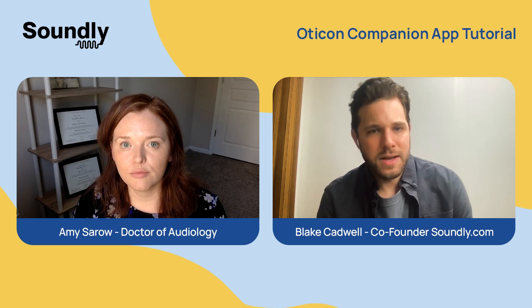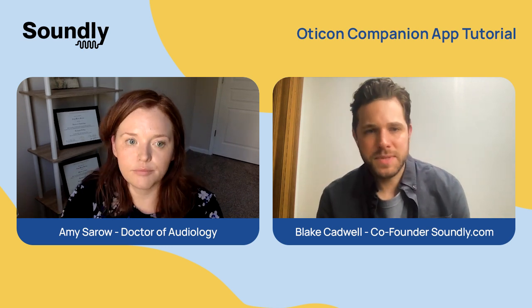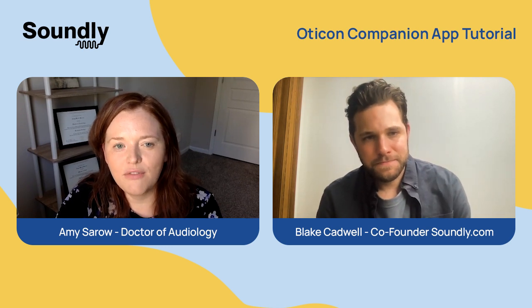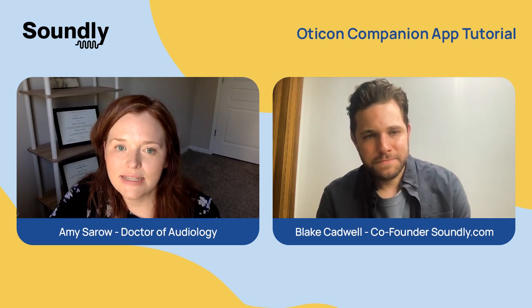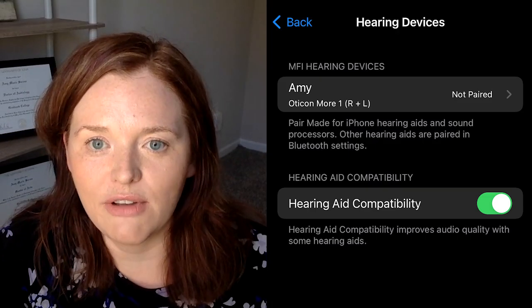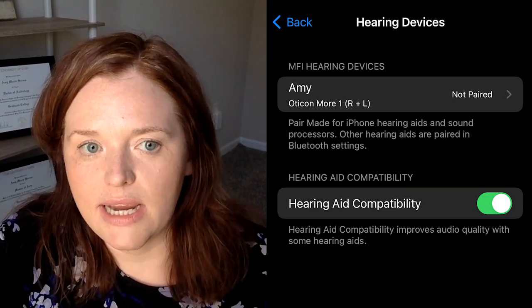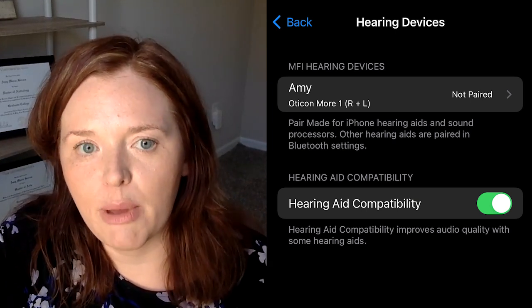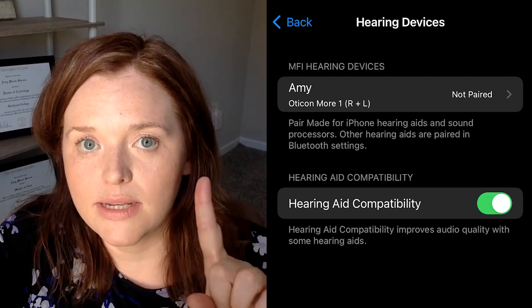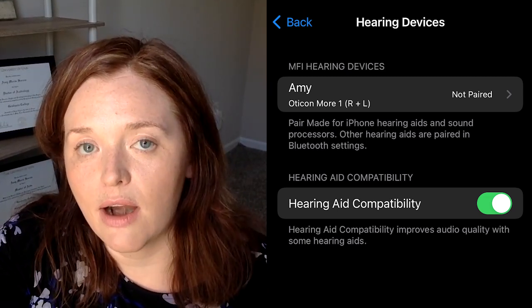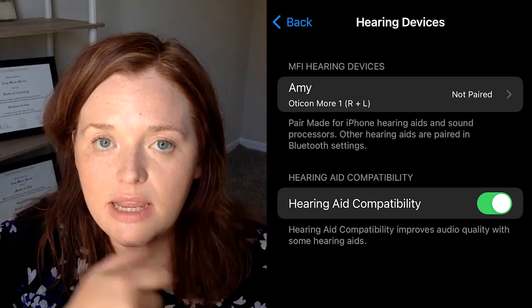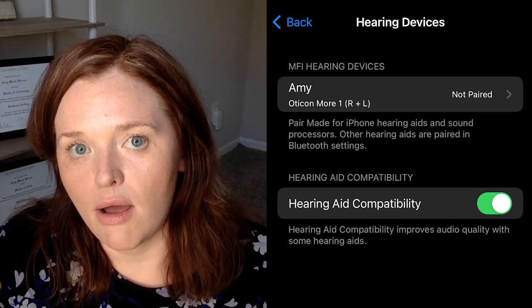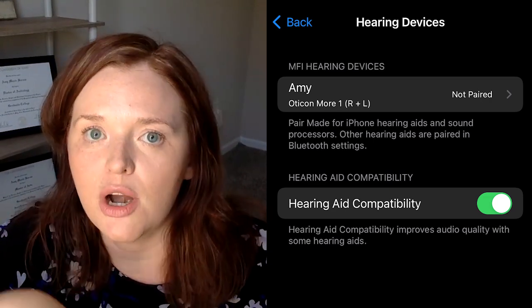So can you take us through the process of downloading the Companion app, syncing it to your hearing aids, and then ultimately some of the controls that will give you? Of course. So if you have an iPhone, you'll start by going to Settings, Accessibility, and then Hearing Devices. You'll see at the top of the screen the hearing aids that will pop up — right and left. If you have a pair, you'll see where it says 'not paired' — you'll want to select that. If you don't see that there, what you'll do is restart the hearing aids by either holding the button down to turn them off and then holding it again to turn them back on for a few seconds, or put them in the charger and pull them out.